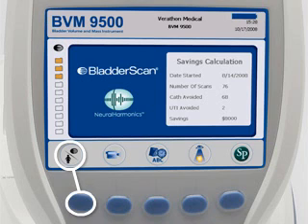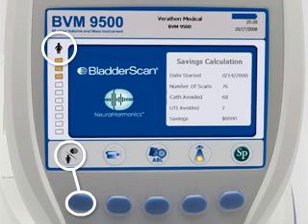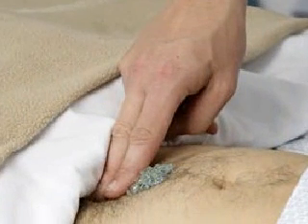Press the button until the desired setting appears. Select to scan a male patient or a female patient who has had a hysterectomy. Select to scan a female patient who has not had a hysterectomy. Start with the patient in the supine position.